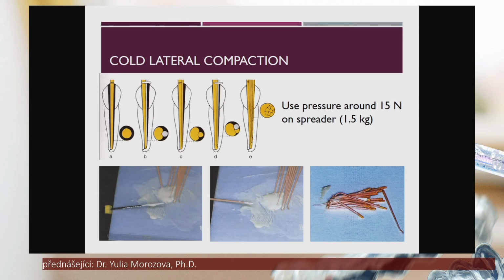our root canal. First of all, we mix the sealer and put the sealer using a small hand instrument onto the root canal wall. In this case, please don't use a lot of sealer, just a small amount, put it onto the canal walls, then put a really small amount onto the master apical cone, and gently put this master apical cone in until it finishes on the apical seat.